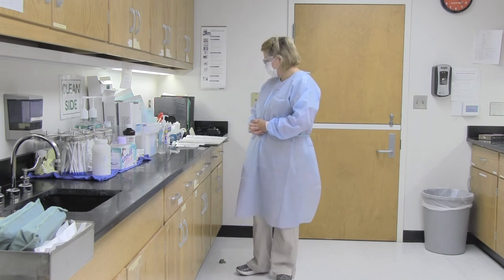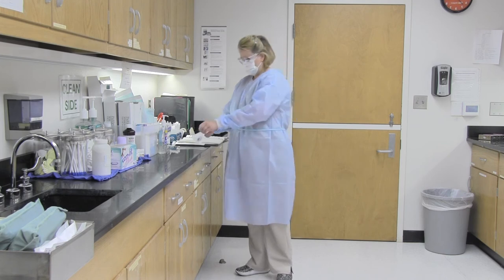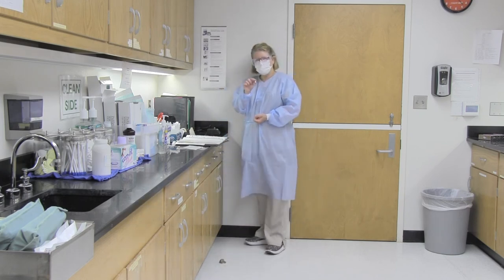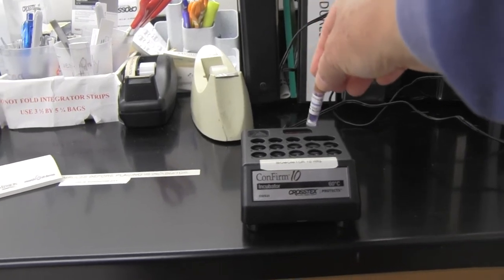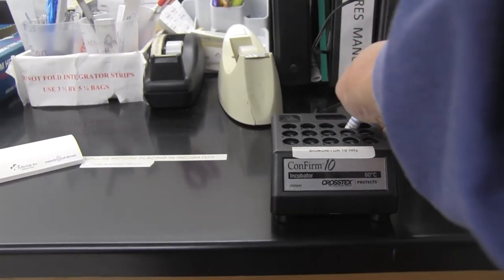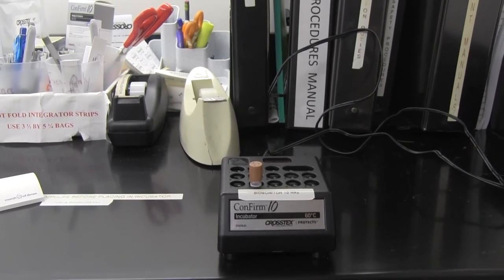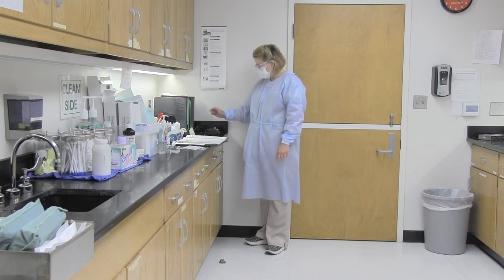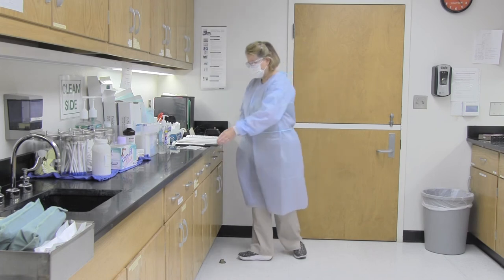Crush the biomonitor and control ampoules and place them in the incubator. The biomonitor was heated in the autoclave. Take the biomonitor from autoclave 1 and crush it on the right side corner — place it and push until you hear a little snap. That goes into slot number 2. Crush the control and place it back into slot number 1. Record the biomonitor start time and slot numbers in the monitoring book.